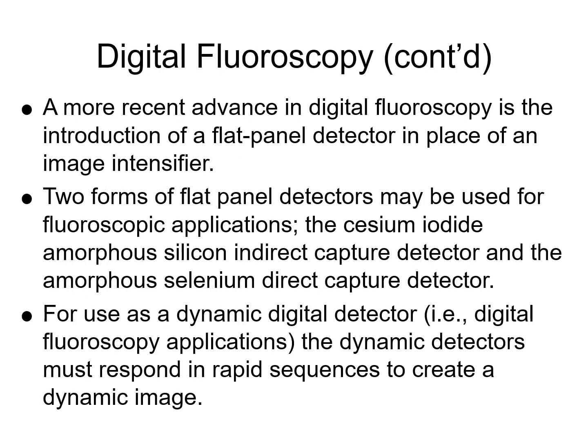Okay. So the more recent advance is, instead of just tacking a CCD with fiber optic piping to the output phosphor, to get rid of the image intensifier altogether and just replace it with a flat panel detector. Okay? So the flat panel detector is basically the new technology. Flat panel detectors is basically we take the CCD and we improve it, and then we re-engineer it with a top layer specifically designed to capture X-ray, not visible light.